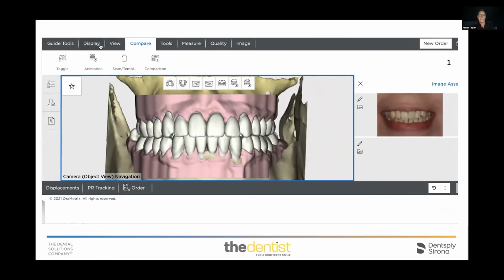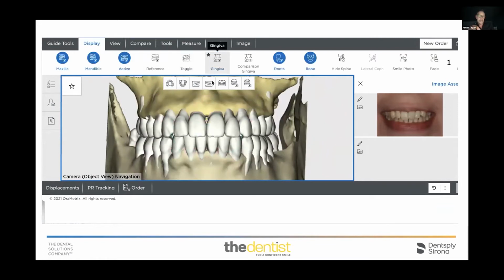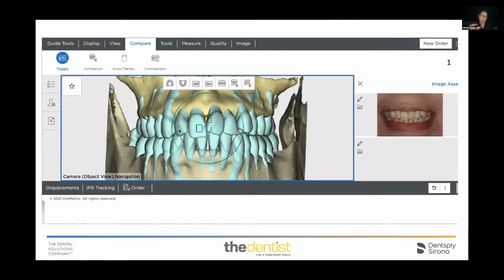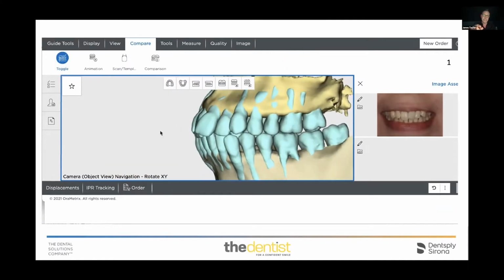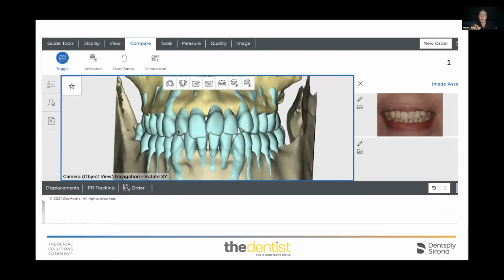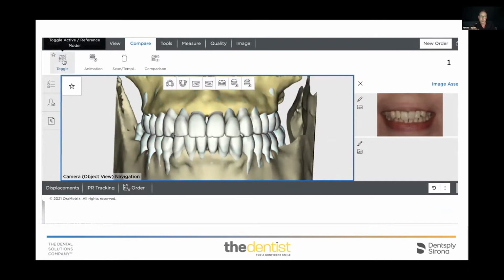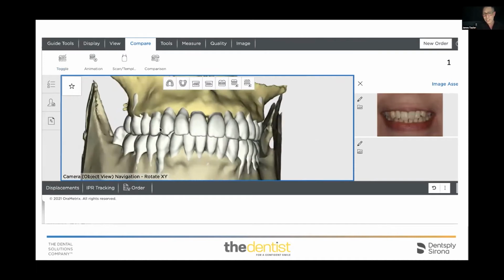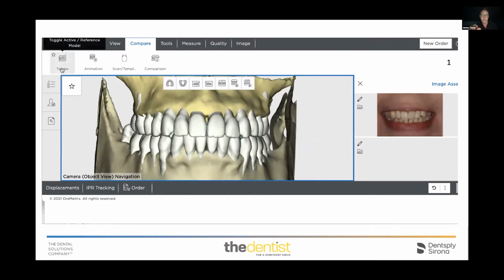changes that I need. As you'll see, not only do I have the gum on there, but I have the bone as well. So I can now take the gum away because I've integrated my CBCT in this, and I can see exactly where the roots are within the bone. So I have an opportunity not only to improve the position of the teeth and the occlusion, I can also now improve the position of the roots in the bone. And I can see potential hazards and issues that this is going to cause.